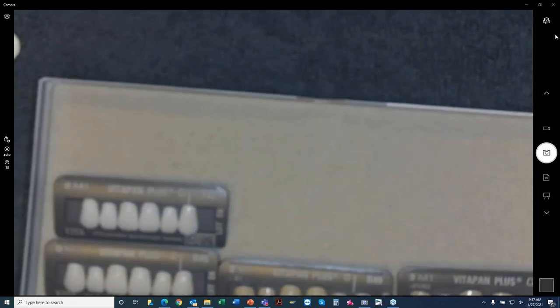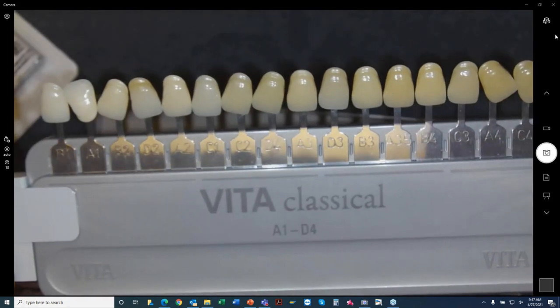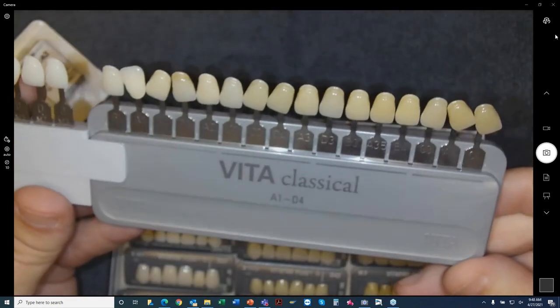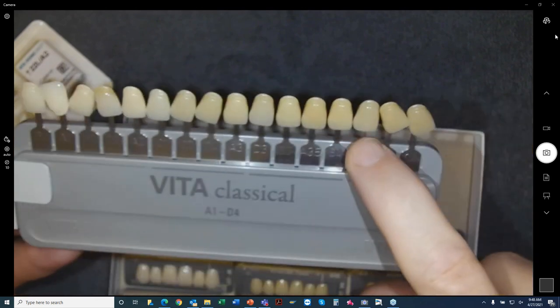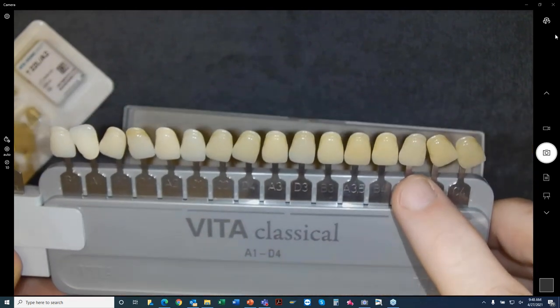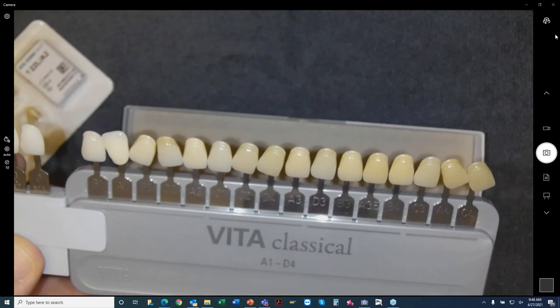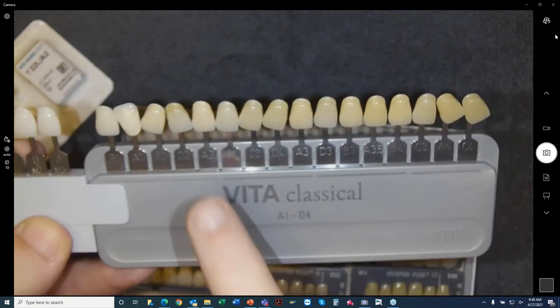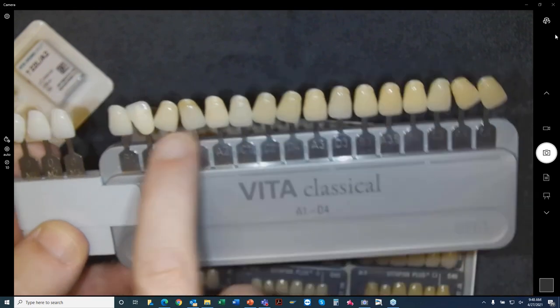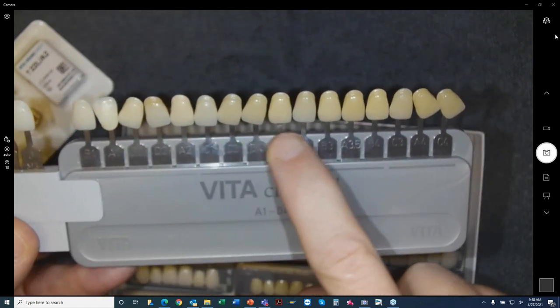And then something else to talk about is that normally we take shades using maybe a shade guide, right? Usually it's a classical shade guide. They look at all the shades and try to determine what shade that patient is. Well, we know that many dentists, over 50%, have remakes due to inaccurate shade taking. They're either brighter or darker than what they should be. Some offices have a hard time even selecting shade for crown and bridge, let alone denture teeth, because they still use these for denture teeth.